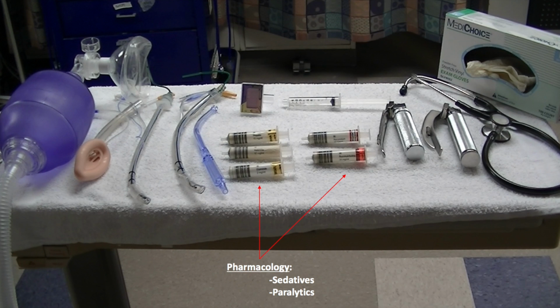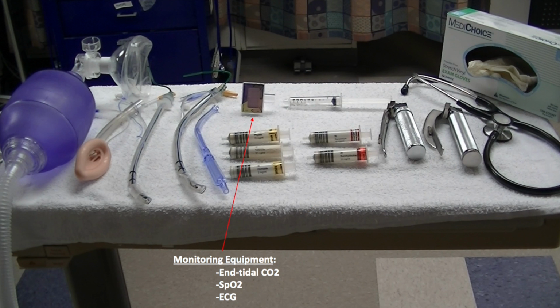The P in SOAPME stands for pharmacology, and we have already covered sedatives and paralytics in great detail. Finally, monitoring equipment. This is relatively self-explanatory and includes a cardiac monitor, pulse ox, and blood pressure cuff, so you can assess the real-time hemodynamics of your patient while preparing, pre-oxygenating, and intubating your patient.